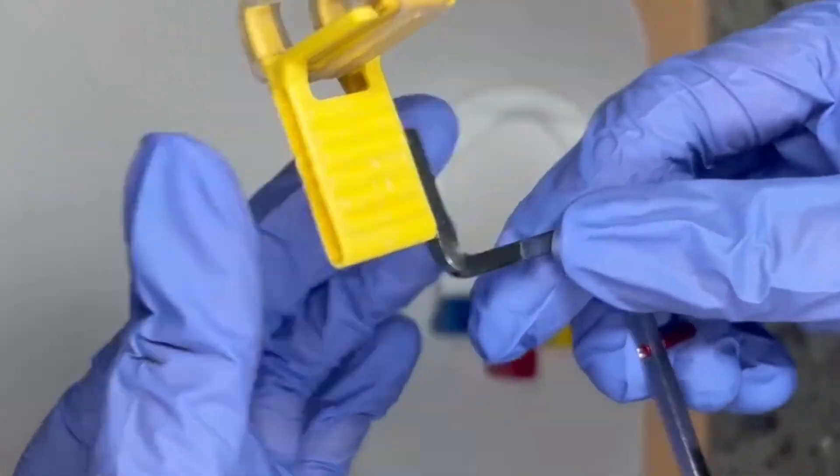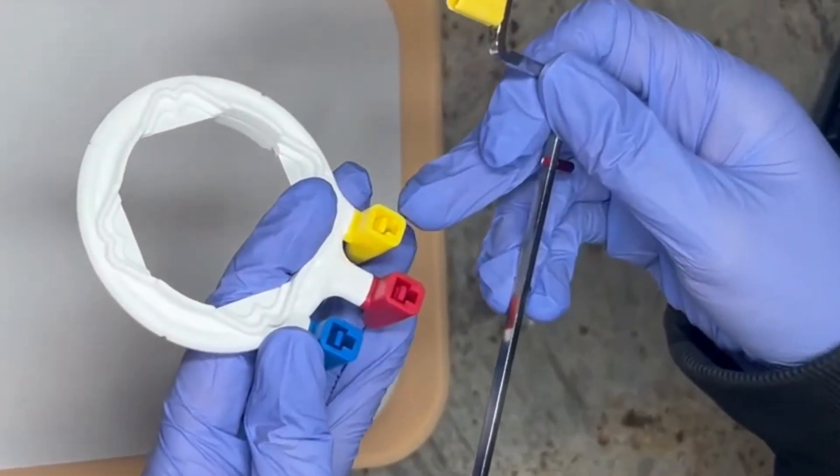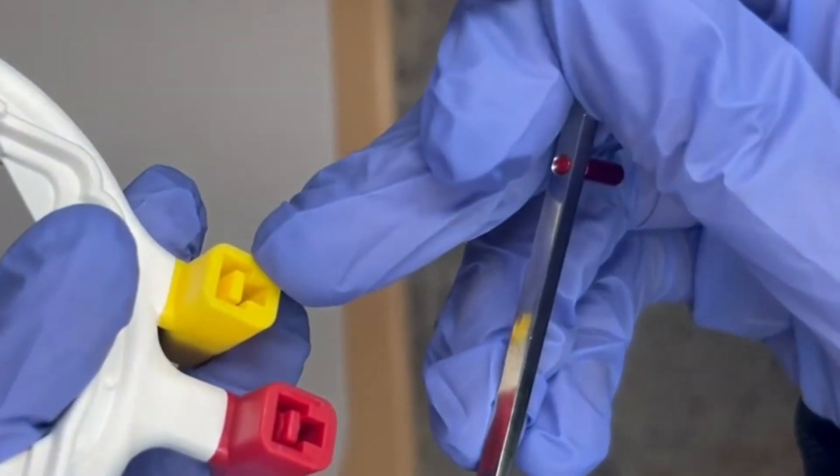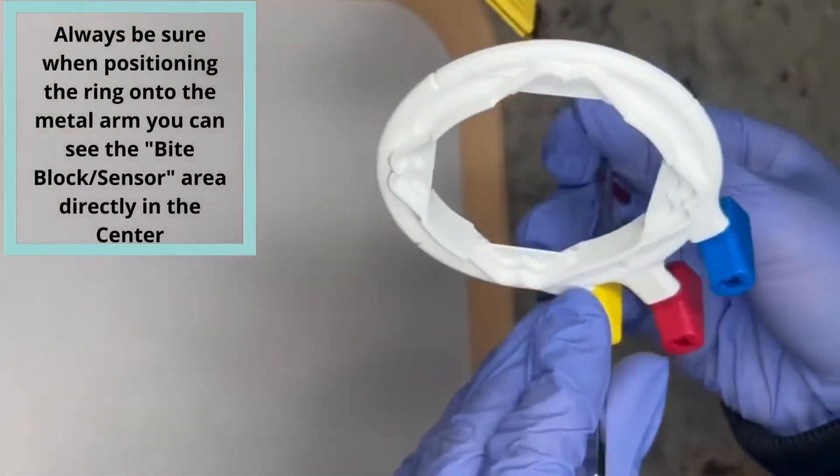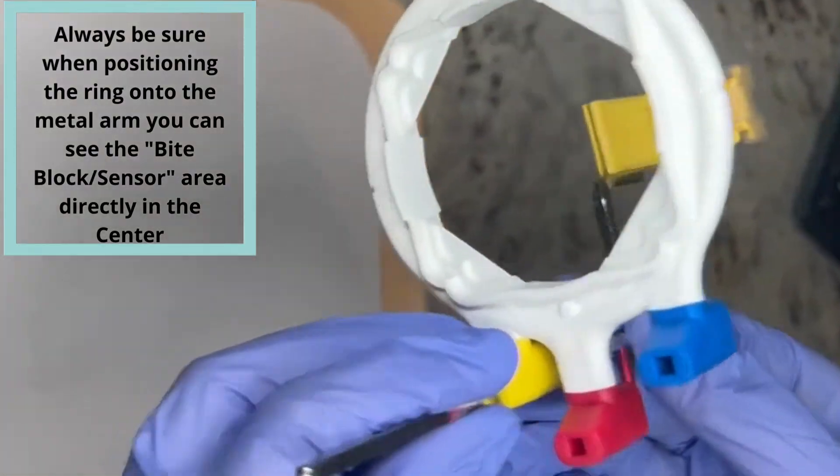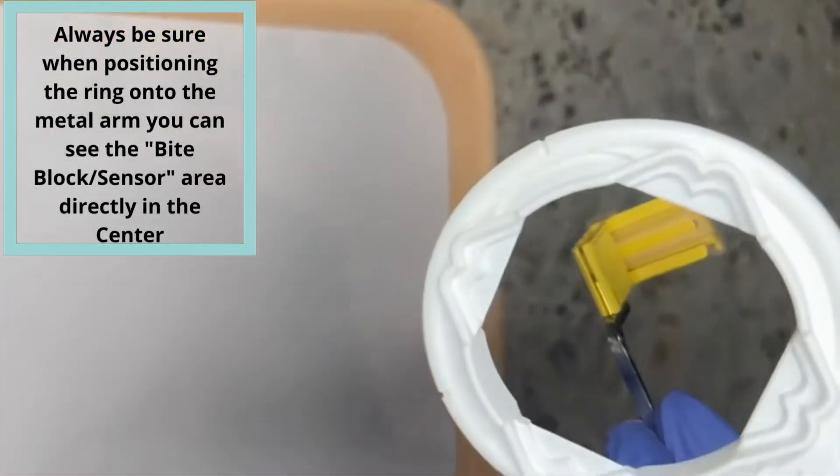Then you're going to take your ring and put it into the yellow part right here. It's just going to go straight in just like that, and as you can see it is perfectly centered to take your posterior shots.